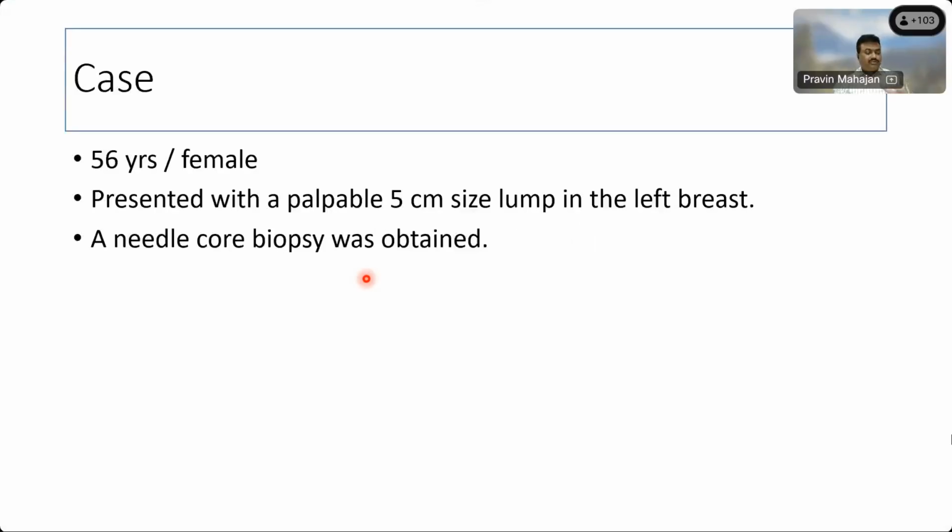Another case, I'll go through two or three cases just to prove the point. On the breast side, when you see such morphologies, what should come to your mind and what should you look for to make the diagnosis? Sometimes you even go wrong just on a true cut, and you see something else in the mastectomy.